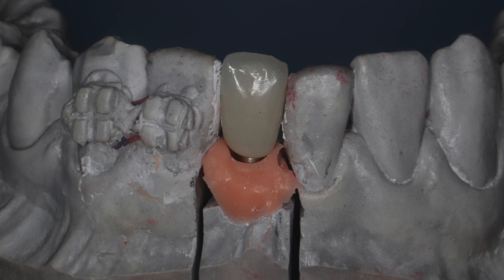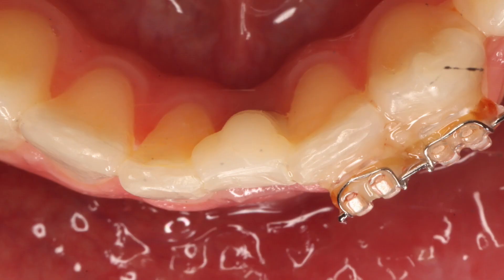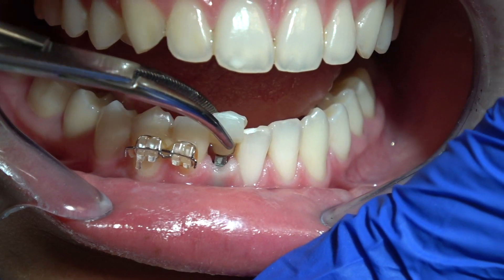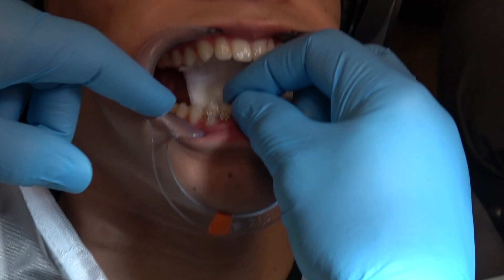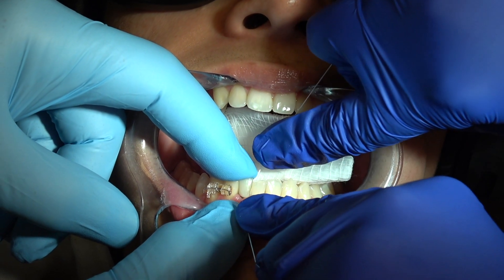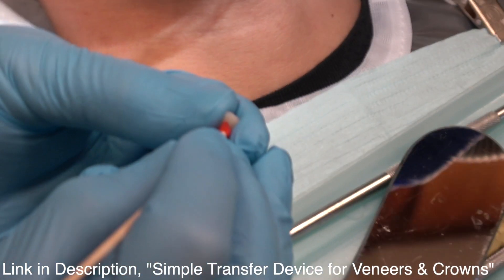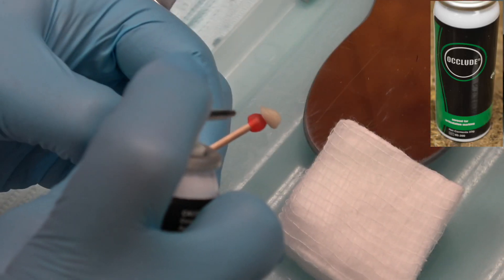This is a lithium disilicate or Emax final crown. Tissue looks good — you can see how thin that tissue is in the apical half of the root. You can use a small diameter implant that's either made for denture retention or one that's made for crowns. I usually just use one that's made the same as the one I use for denture retention — it's got a lot of mechanical retention. I'm checking the contacts; they're a little bit tight, so I'm doing some adjustment.